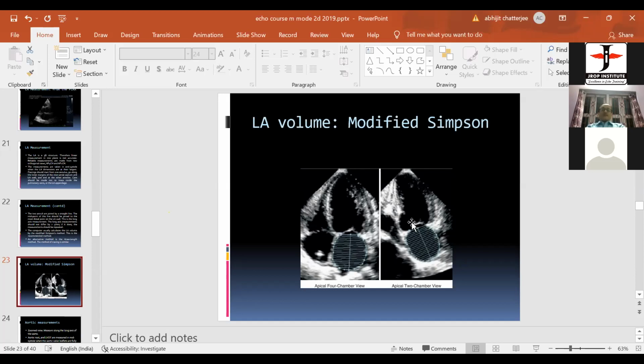The tricuspid regurgitation velocity will be high, thereby indicating pulmonary hypertension. If you are lucky enough, you can see an embolus in transit, and in spite of the hypokinesis of the RV, the apex of the RV will not be hypokinetic. This is known as the McConnell sign, that is the apical sparing. Am I clear to you?